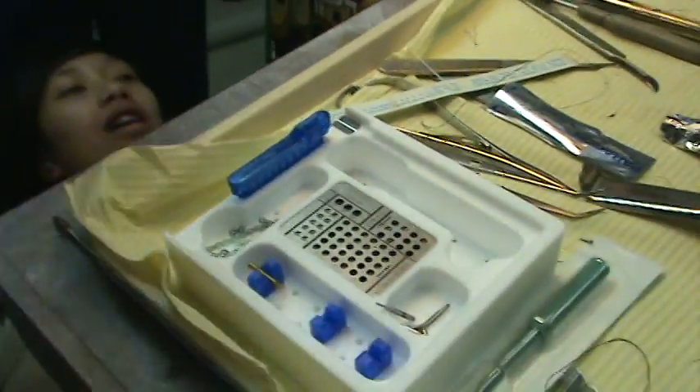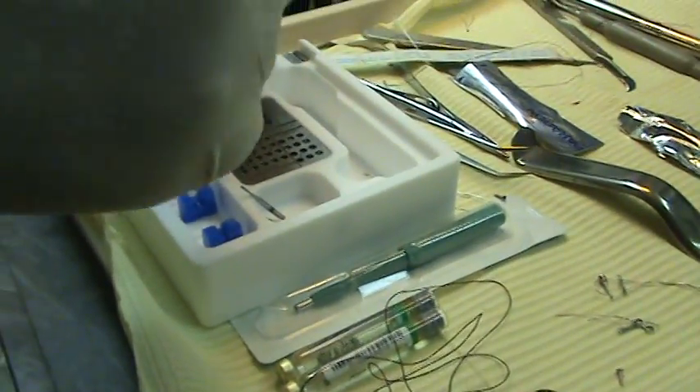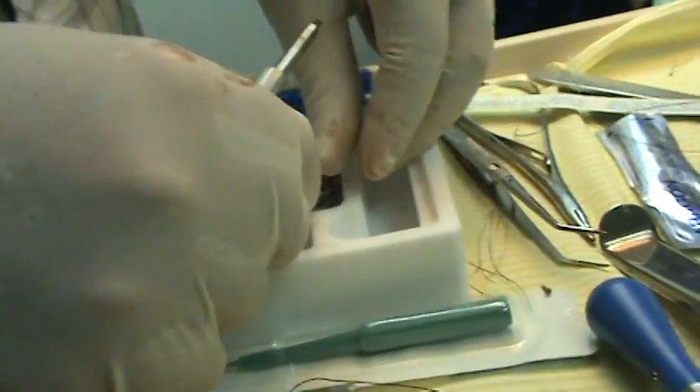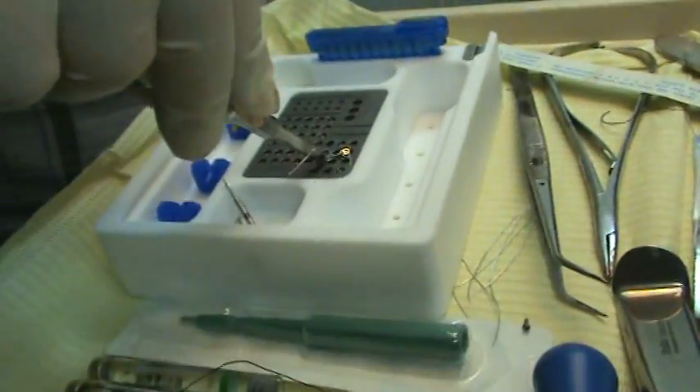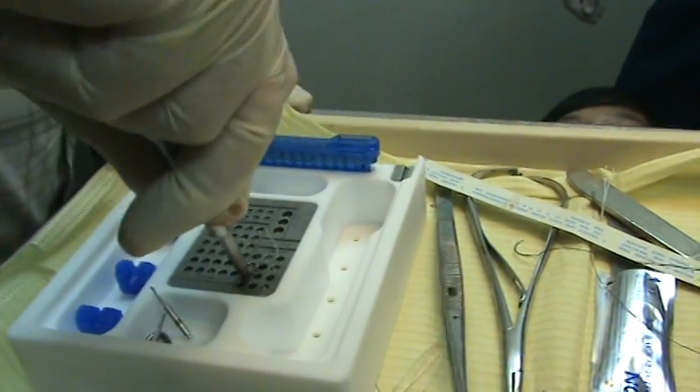This applies to the orthodontic screw. I think you're not used to this — you're used to the little things where you just kind of pick them up and put them on with your fingers. If you have it going, press it out.